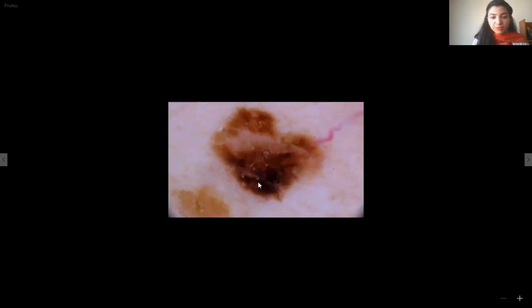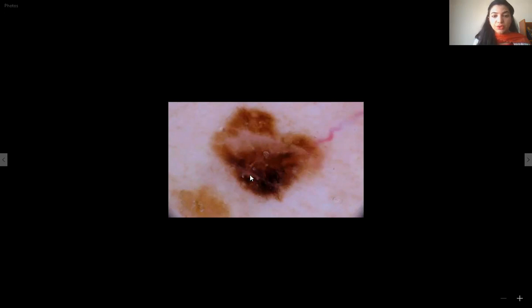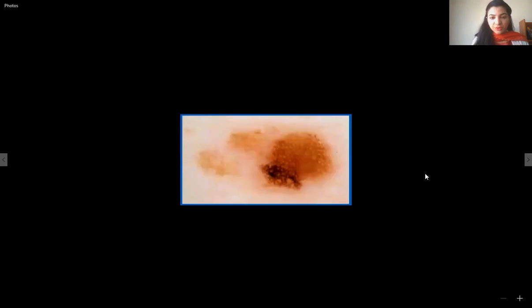As you can see in this image, there is color variegation and a pigment blotch — a very dark black area on one side of the lesion that completely obstructs light from going further inside. There are peripheral radial lines and a structureless area on one side as well as on the top of the lesion. This lesion is not symmetrical, and it is showing peripheral radial lines and a pigment blotch. This one qualifies for melanoma.